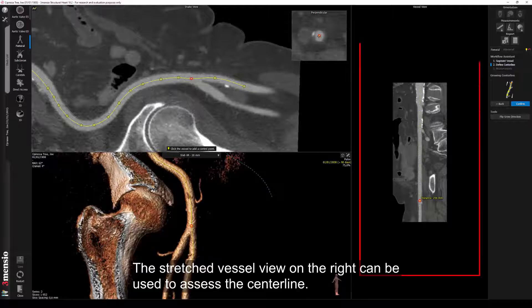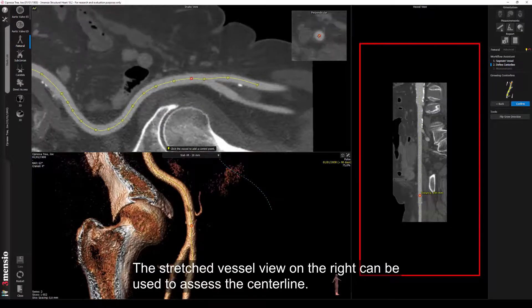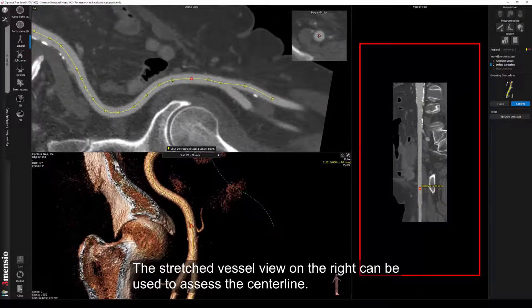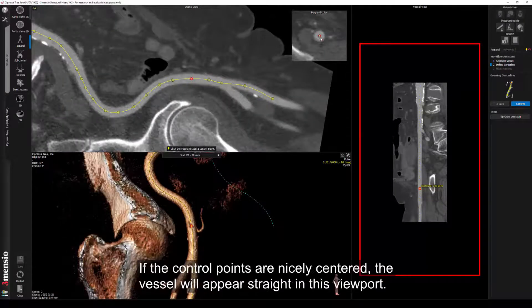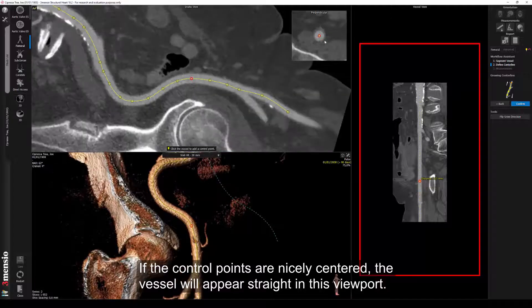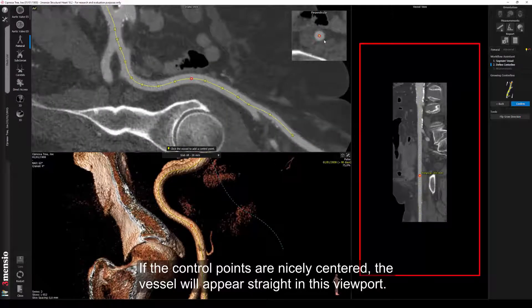The stretched vessel view on the right can be used to assess the centerline. If the control points are nicely centered, the vessel will appear straight in this viewport.